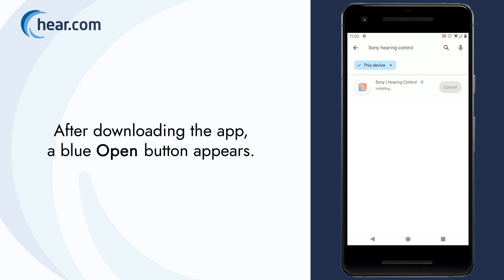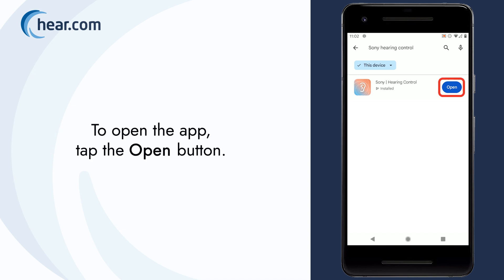After downloading the app, a blue Open button appears. To open the app, tap the Open button.